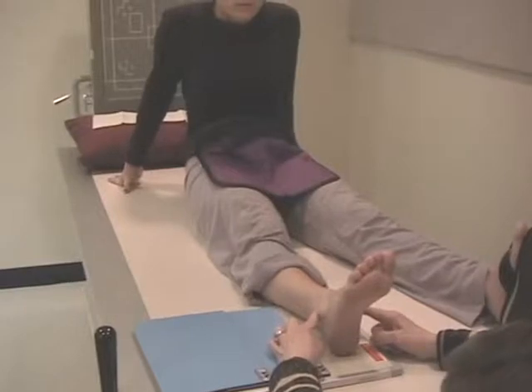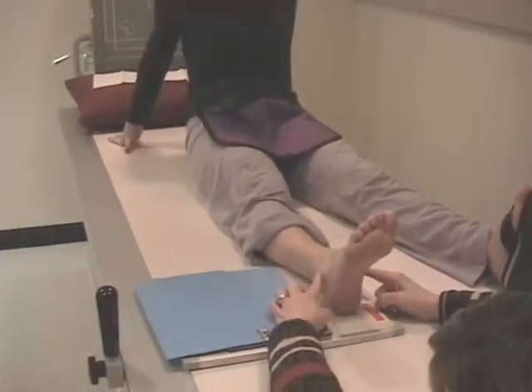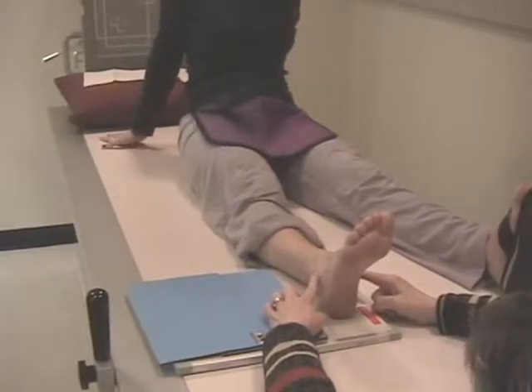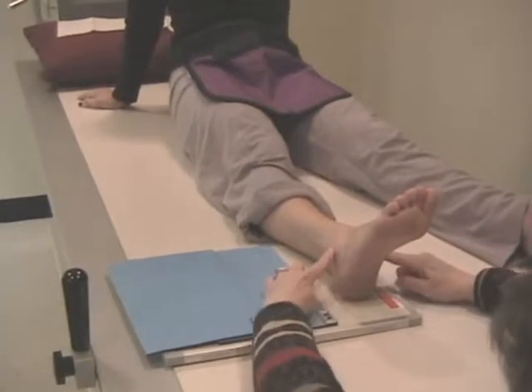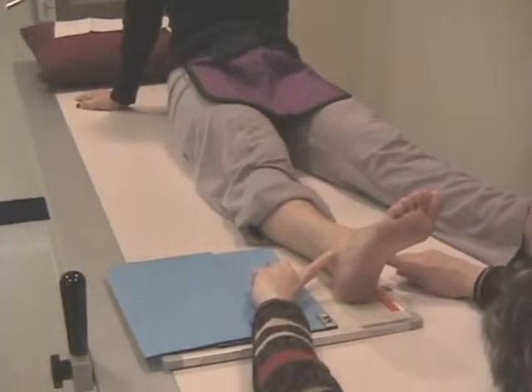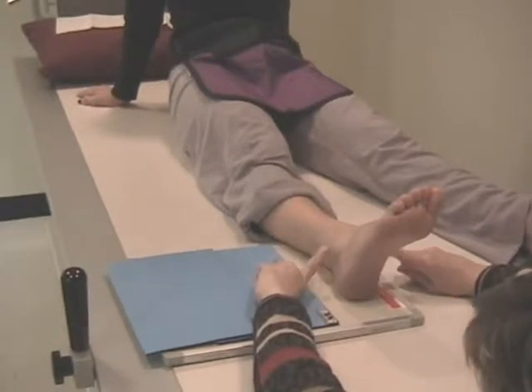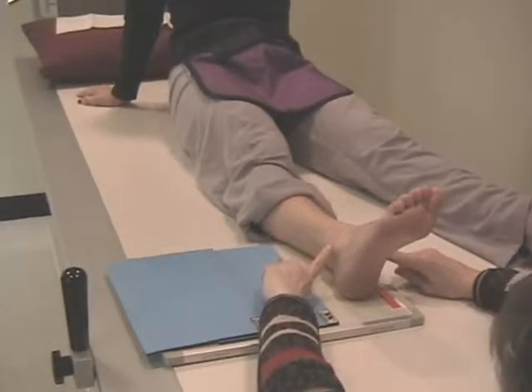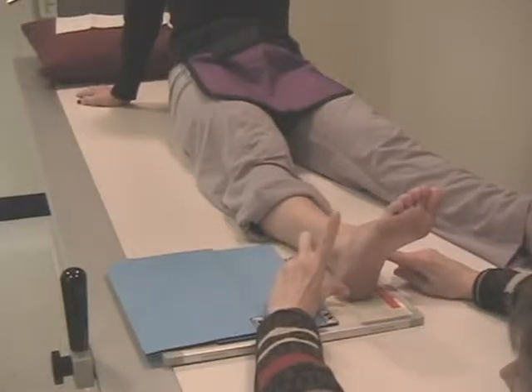You will know precisely how far to oblique the leg if you look at the intermalleolar line. Now, Jacqueline needs to rotate her leg in medial just a little more, and I'm putting my fingers right on the very tips of the malleoli, and I'm making sure they're parallel to the plane of the cassette. And in Jacqueline's case, we are about a 15-degree obliquity. Can you see that? Okay.